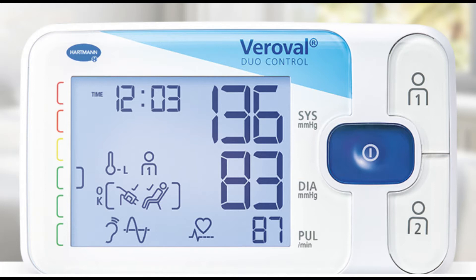The monitor's display is prominent. Systolic, diastolic, and pulse indicators are on the right side. On the left side, color indicators reveal if your blood pressure is normal, elevated, or high.